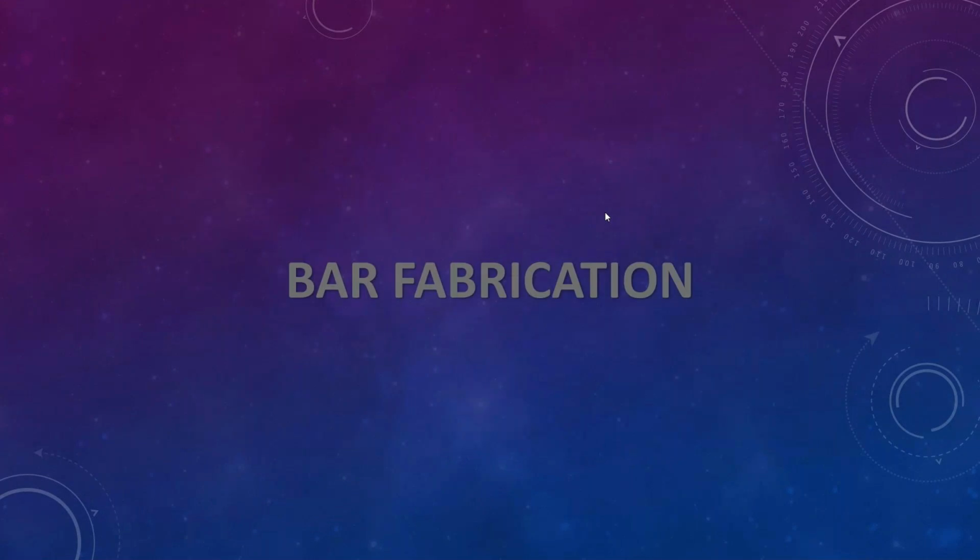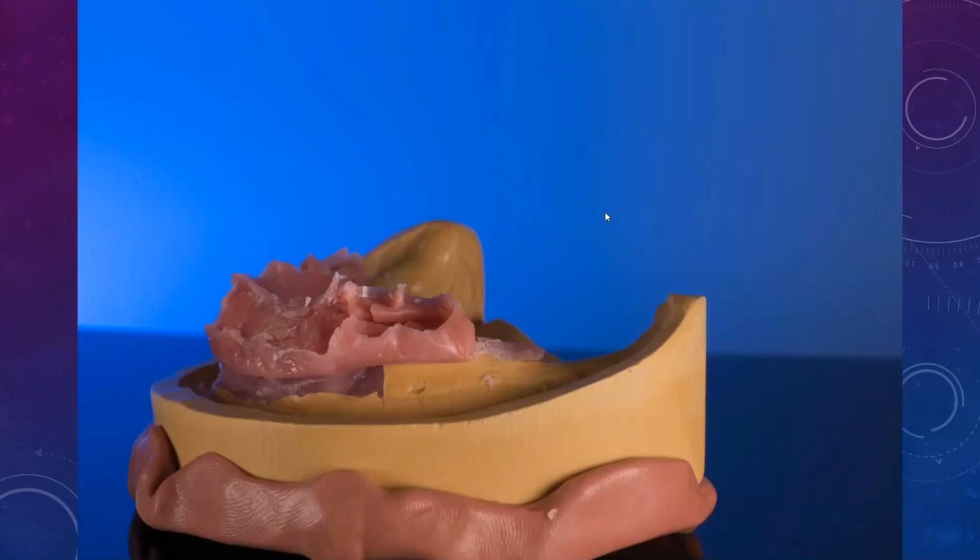Okay. So now that we've done the prototypes and the patient's been wearing them for a while, we can either go forward to making a zirconia restoration, or if we're making a wraparound acrylic one with a hybrid bar, we need to design the bars. It's been a journey for me, guys, and if you've listened to my lectures throughout the years, you've seen me start at one point and I've arrived at a different one right now. So what I started with is I tried just to pull the teeth out and scan that so I know where to end the bar, because technically where the wax ends, the tooth will begin. So I knew if my bar went above this wax portion, it'd be into the tooth.